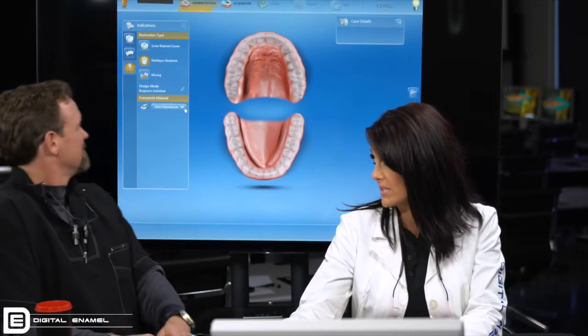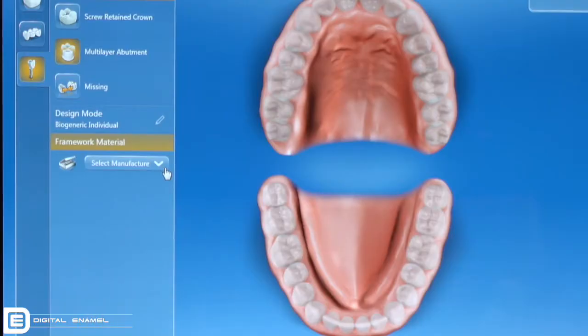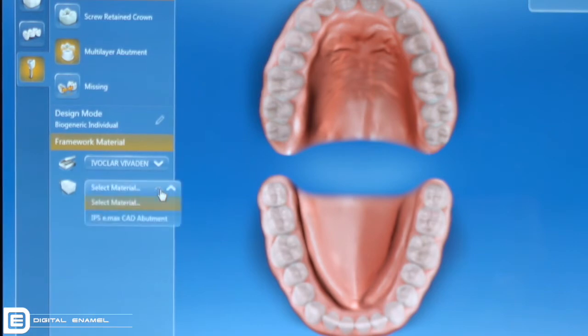Next you're going to be able to set up your framework material. When you select your manufacturer, you're going to have Sirona, Vita, and then Ivoclar. So we're going to say that we're going to do E.max — we're going to select Ivoclar and then do E.max.